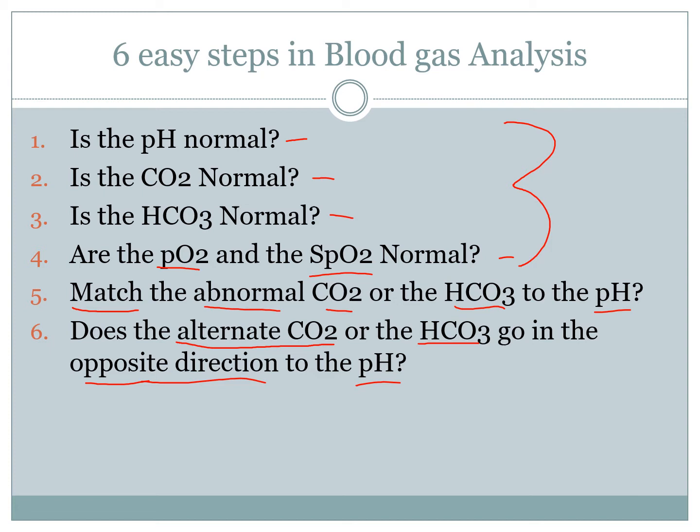The first couple of steps are pretty easy, then it gets a little bit harder, but I'm going to walk you through each step, and then we've got a bunch of examples at the end that we can work through together. So what I would recommend is take the time, pause the video, and write down these 6 steps, because then at the end of this video you can practice the skill sets and get comfortable with blood gases. But before we get there, let's break down these steps.